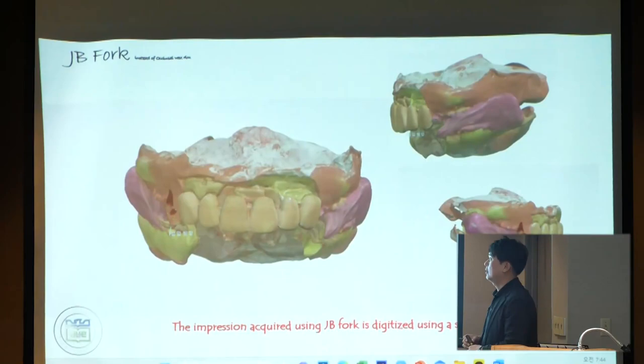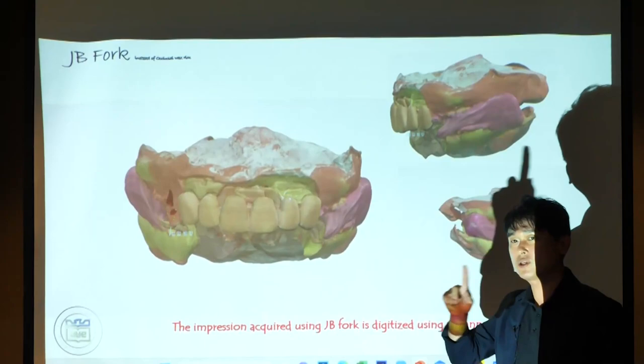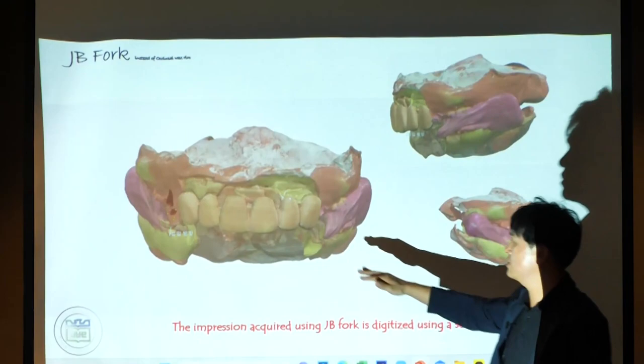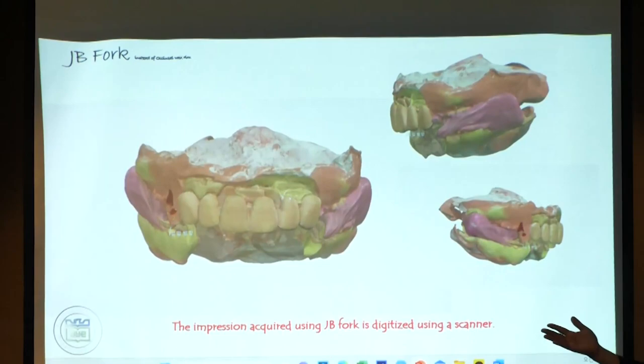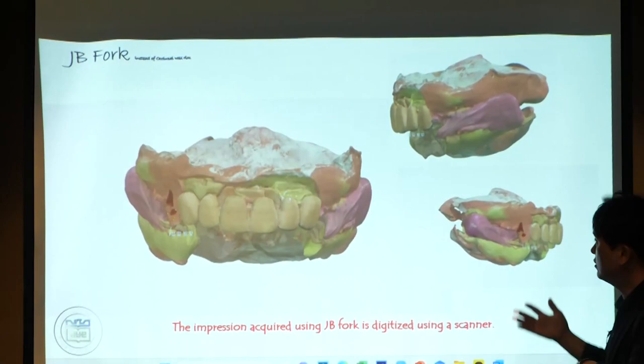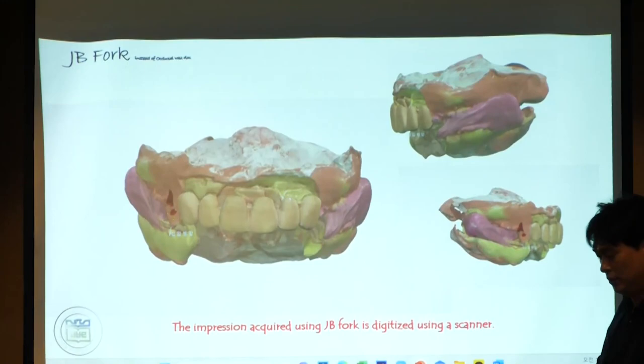Anyway, the next procedure is all for the dental lab, you know. So anyway, if you have an intraoral scanner, you can scan upper, lower, and then you can scan this one directly. This JB fork bite, you can scan the bite directly. And then it is not necessary to send any model or silicone material to the dental lab. You can send this information by email. And the next time, the temporary denture will be delivered to my office. I will skip the lab procedure.